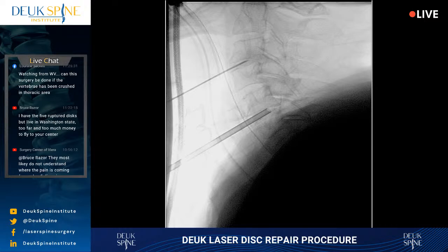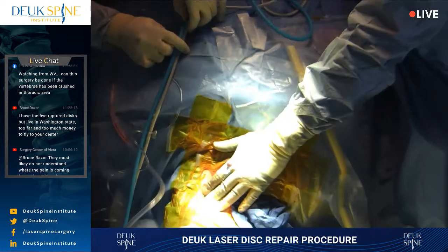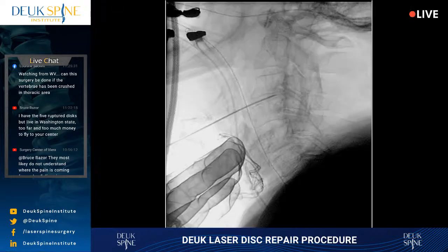There's no water in the suit. No, they sweat. They get hot. Yeah, that's a cool suit. So there's two types of cars. There's those with a, interesting. The needle advanced a little bit at C3-4. But it's still safe.